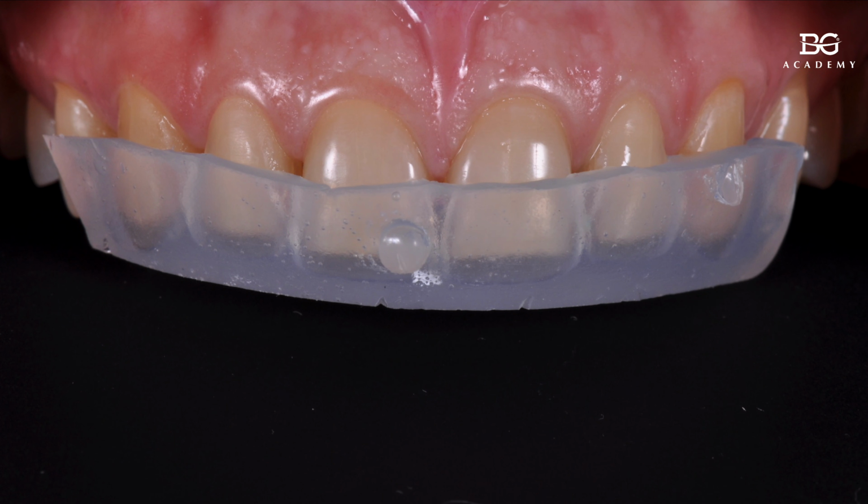As you can see on this screen, you will have the same silicone if you are not using transparent, for example. But why I'm showing you transparent silicone is that in such a case you can use any type of composite, any shade, any opacity, any brand of composite you want. So you will not use bisacrylic in such a case, you can use flowable composite, or you can use packable heated composite if you want to reinforce your temporary restorations and to keep them for a long time. For example, I don't know why, but let's say you want your patient to have those temporary restorations for more than 14, 15 or 20 days.